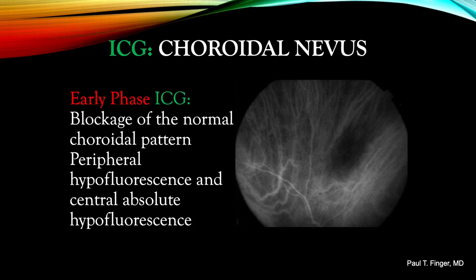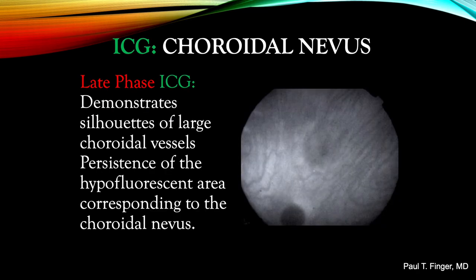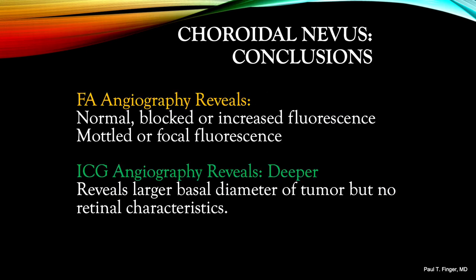In the early phase ICG, we see blockage of the normal choroidal pattern, peripheral hypofluorescence, and a central absolute hypofluorescence. In the late phase ICG, we see silhouettes of the large normal choroidal vessels with persistence of the hypofluorescent central area corresponding to the choroidal nevus. Even in the late phase, its pigment blocks fluorescence. In conclusion, choroidal nevus fluorescein angiography will reveal normal, blocked, or increased mottled hyperfluorescence. Focal fluorescence is seen with a breakdown of Bruch's membrane and the RPE, as well as tumor-associated choroidal neovascularization. Indocyanine green will reveal larger basal dimension tumors, but no retinal characteristics.